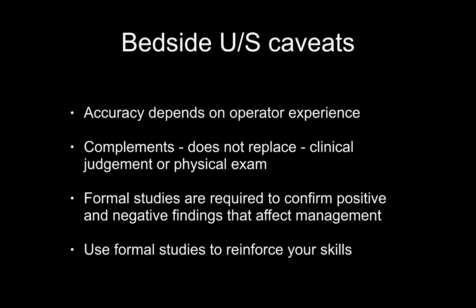Ultrasound doesn't replace a good physical exam, it doesn't replace clinical judgment. It's simply an additional data point that has to be put back into the overall clinical context to be useful. Finally, if a positive or negative finding is going to affect your management, I think it's good practice to order a follow-up study to confirm your findings. And correlating your findings with a formal study is really the best way to learn ultrasound and to refine your skills.